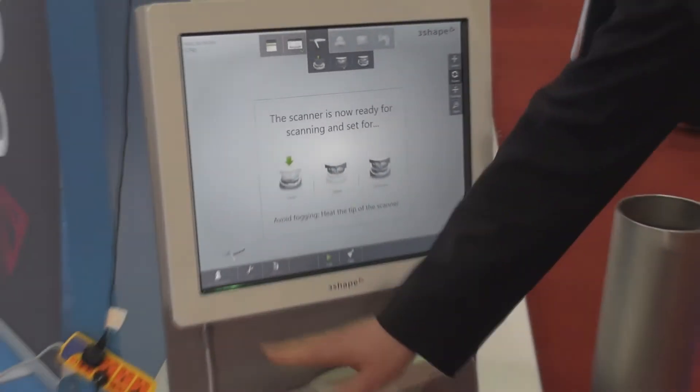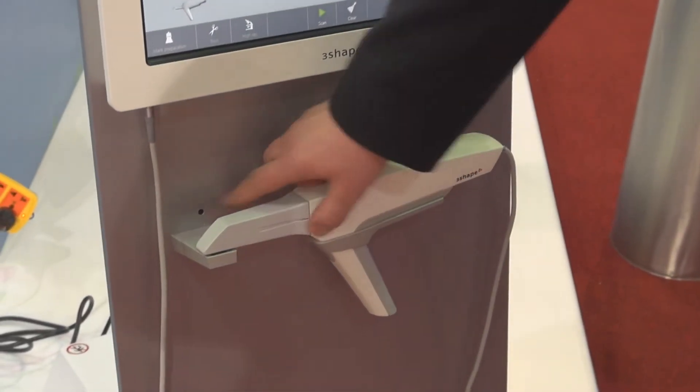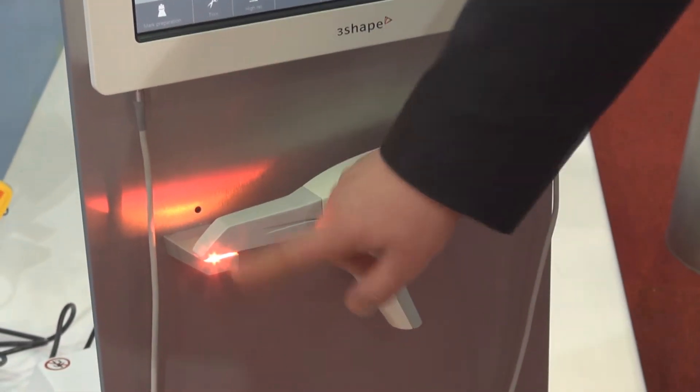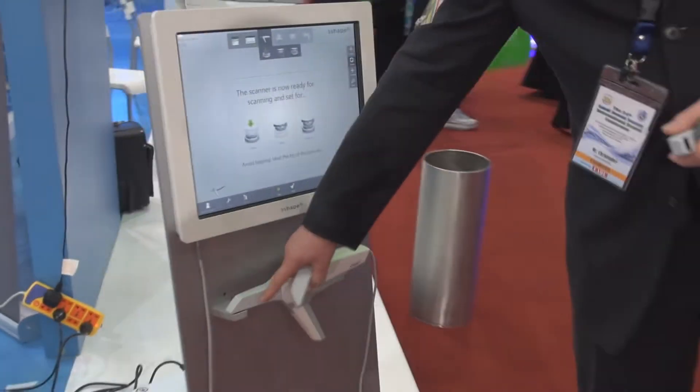We have a scanner with autoclavable tips that could be used roughly around 20 times. As you can see there's a light and a sensor. The light heats up the mirror — inside the scanning tips we have a mirror, and there's also a lens on top of the scanner.